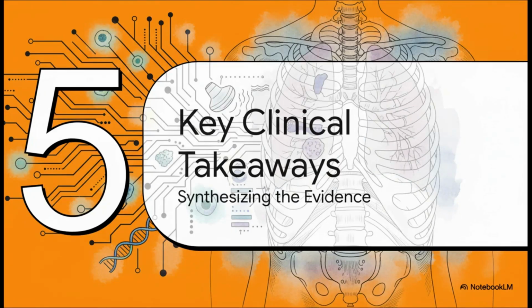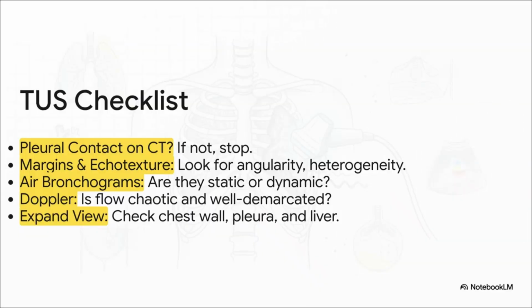All right, let's bring it all home. We've covered a ton of ground here, from the absolute basics all the way to the finer details of characterization and staging. Let's boil it all down into a workflow you can actually use. So here it is. This is your whole thought process on one slide. Rule number 1, the gatekeeper. Is there pleural contact on the CT? If not, you stop. If yes, you proceed.